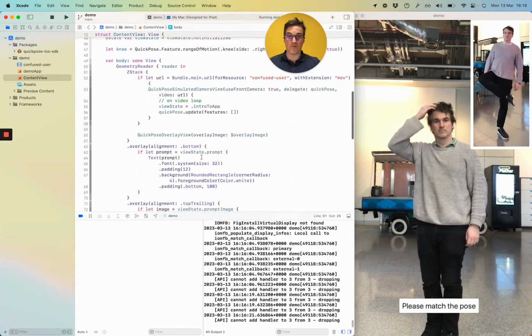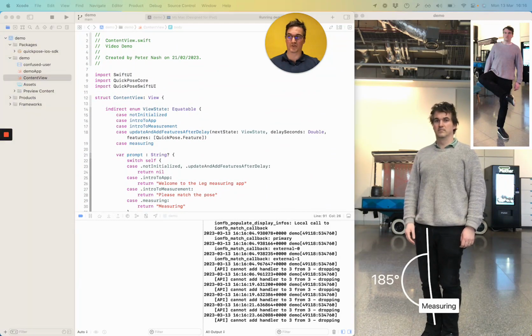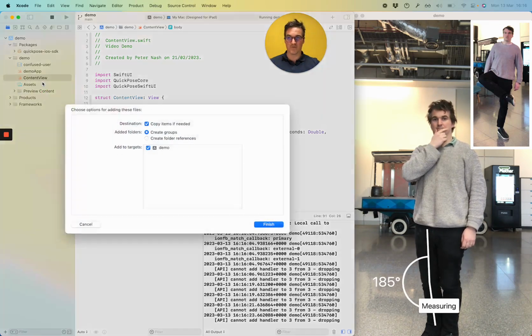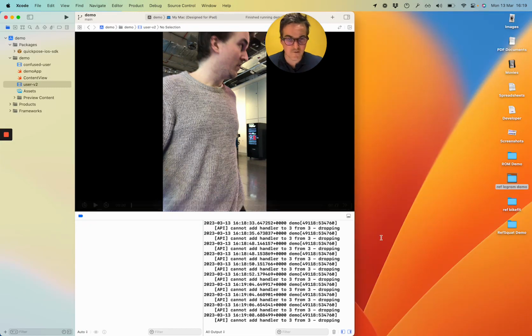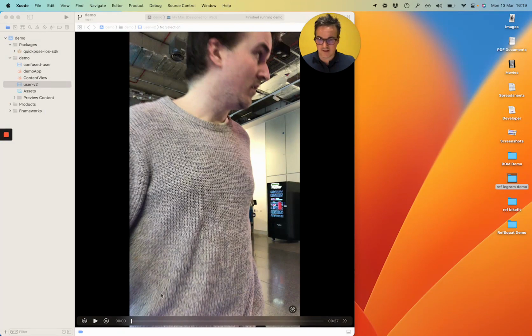So now we've got the second step of this, which is to make this a lot more production ready. That's going to involve bringing in a more final video. So I've copied in this video. I'll just kill this dancing dude for now. Okay. So let's have a look.